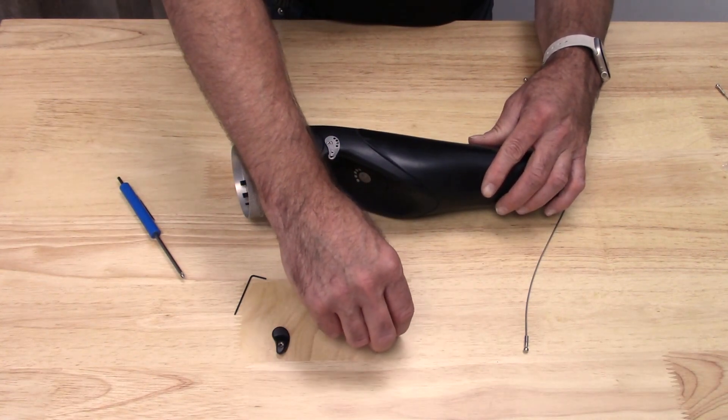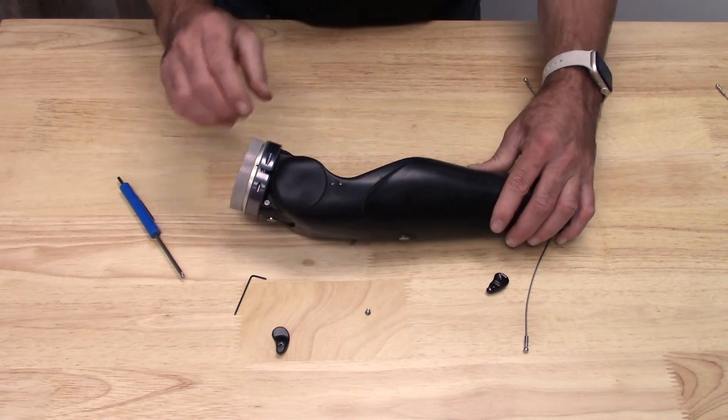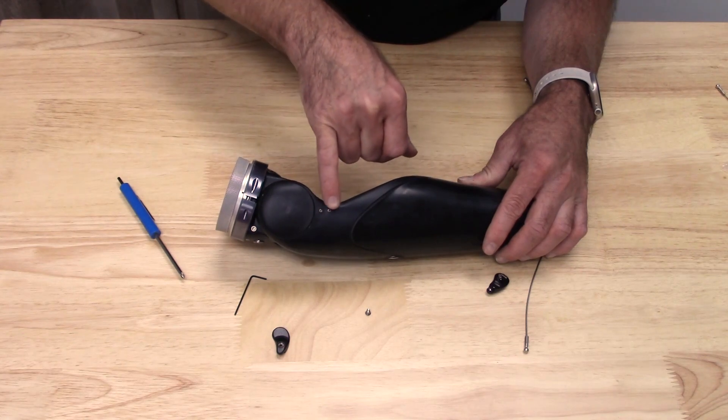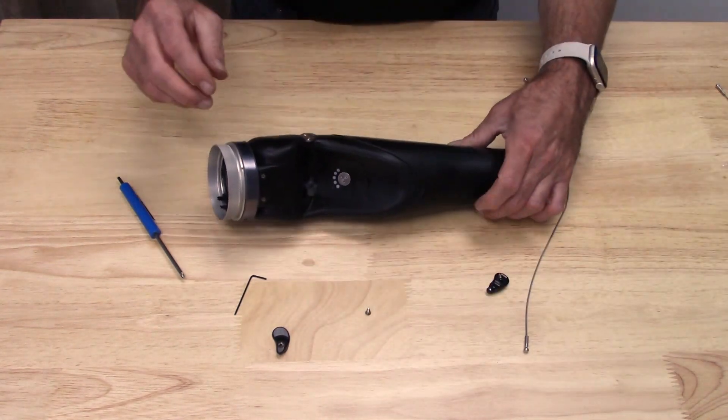You'll notice I have several other set screws here. On this one, you can see on my elbow, I just filled in those other holes on the other side with those. It's a nice way to have some extra screws handy.